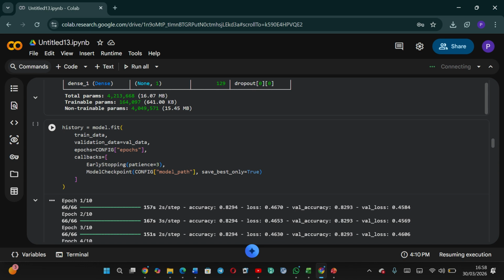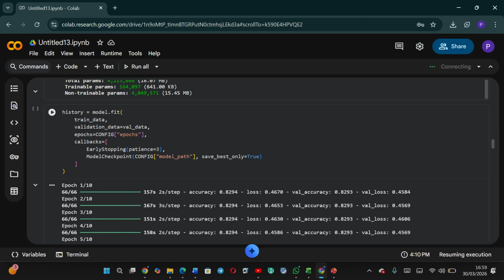So we used a pre-trained model called EfficientNetB0, which is trained on ImageNet. We remove the top layers, freeze the base model to keep learned features, and add new layers like global average pooling and a dense layer with ReLU. This allows our model to classify images as TB or normal.